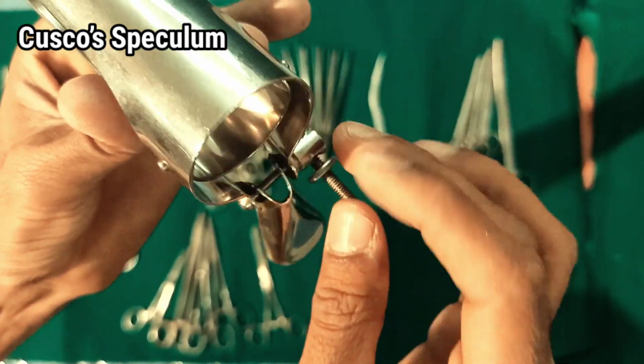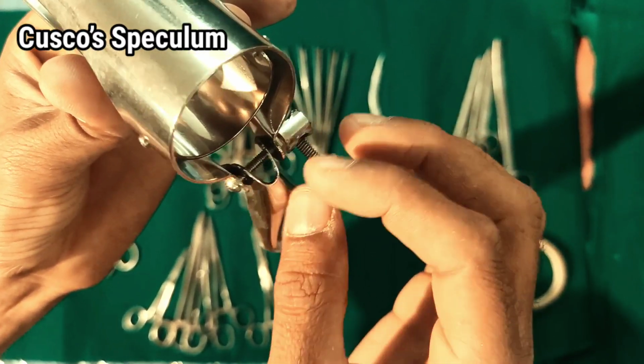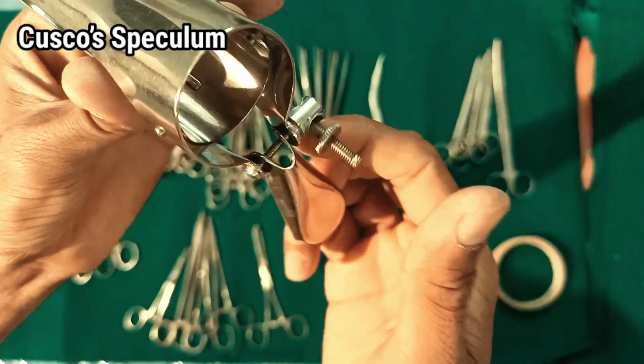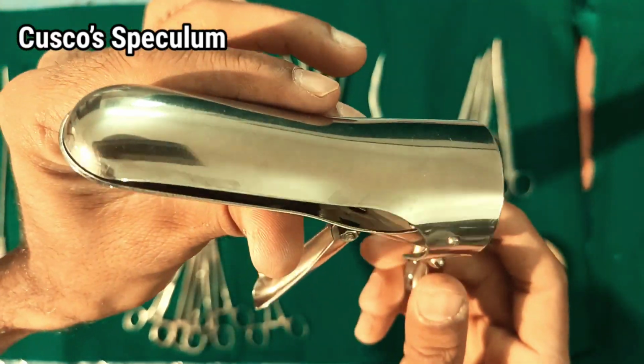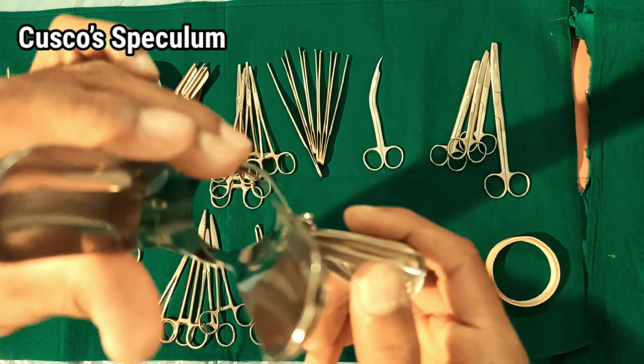However, it reduces the space in the vaginal cavity and therefore is not a preferred instrument for vaginal surgery because it covers most of the vaginal wall. Small lesions on the vaginal wall may be masked by the blade of the device.